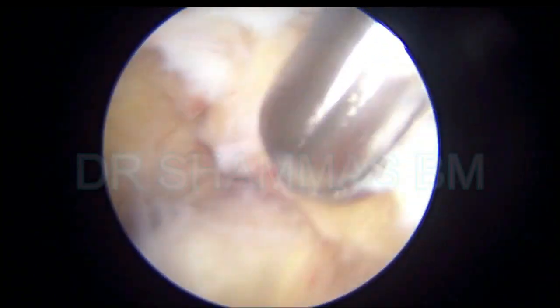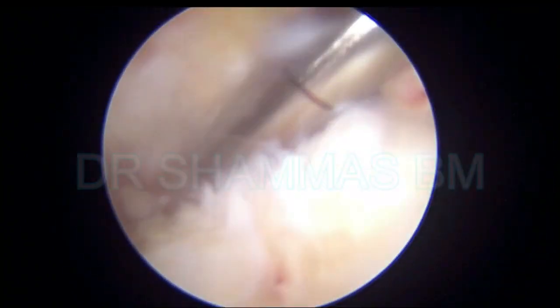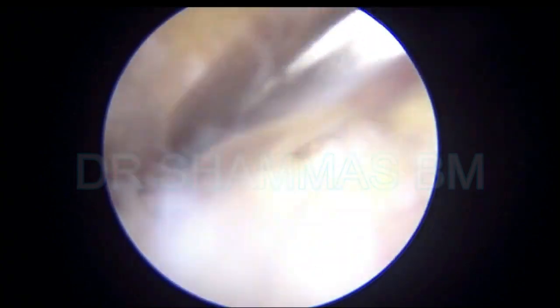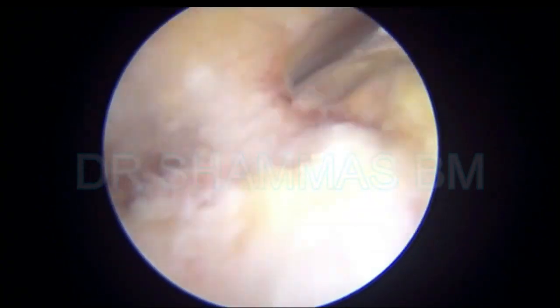Move the joint and see whether you are in the right position. Use the shaver for the soft tissue, a bone cutter when you see the bone, and the burr when you have to burr a hard piece of bone. These instruments are constantly changed and continuously used. Now you can see that I have got the talus and I am clearing the soft tissues over the talus.